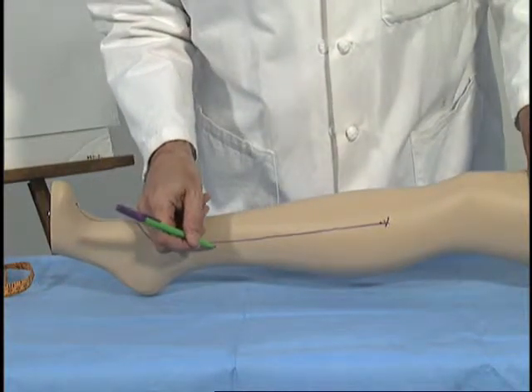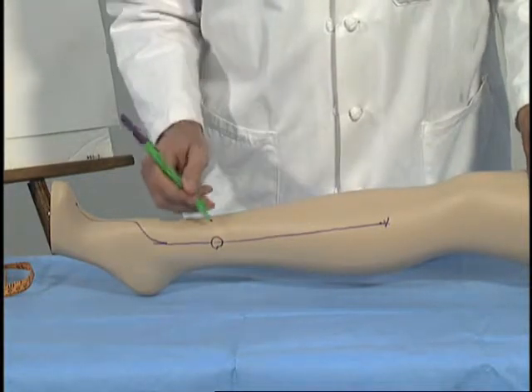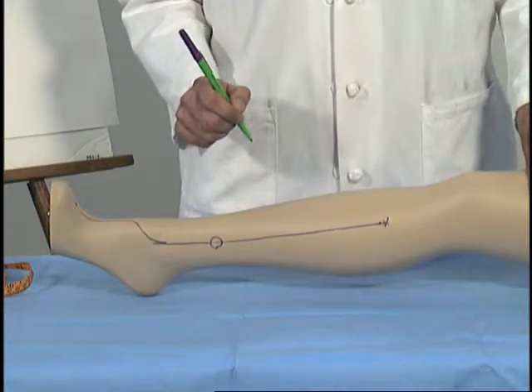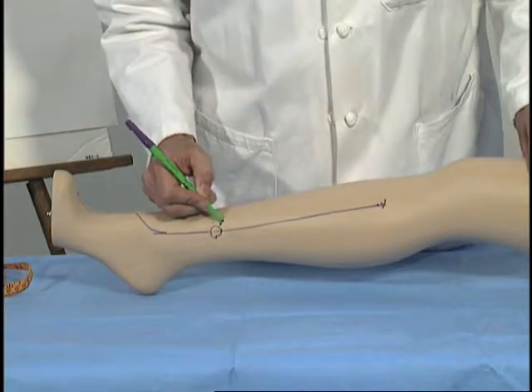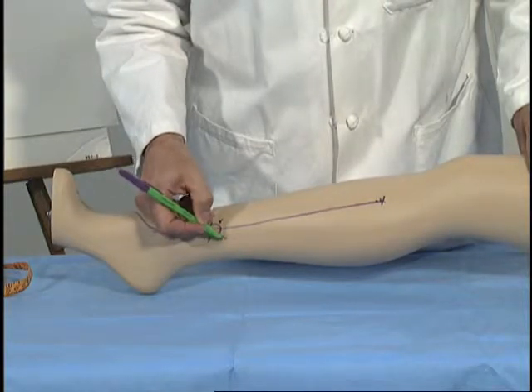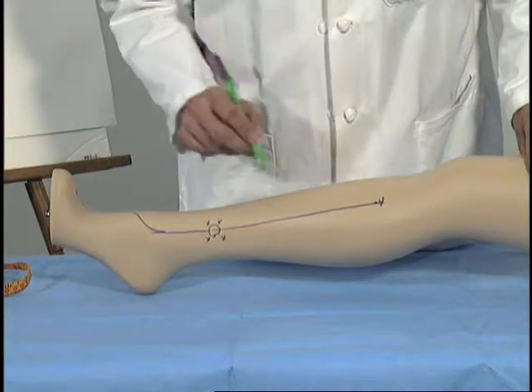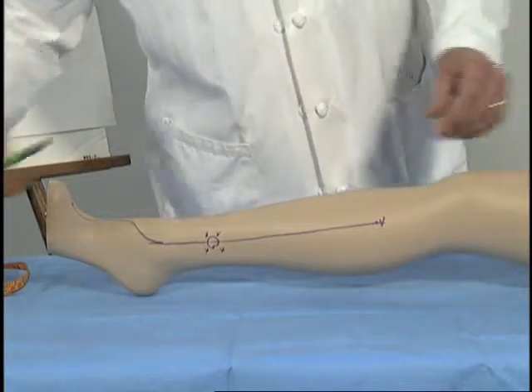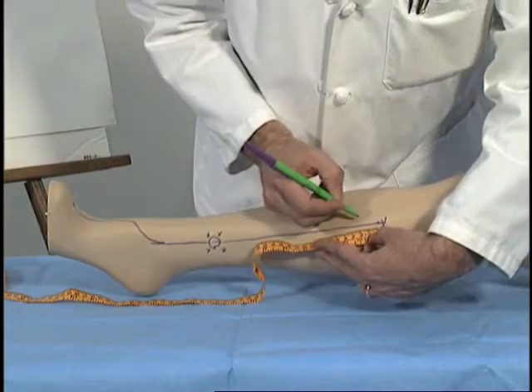Additionally, if there is an ulcer along our treatment course, we'll also space injections around that ulcer, and these will count toward your total. So in this scenario, if we spaced around our ulcer at our typical 1 to 2 centimeter interval, we'd have 4 injections here, leaving us with 36 for the rest of the leg. We'll take and mark those out at 2 centimeter intervals.